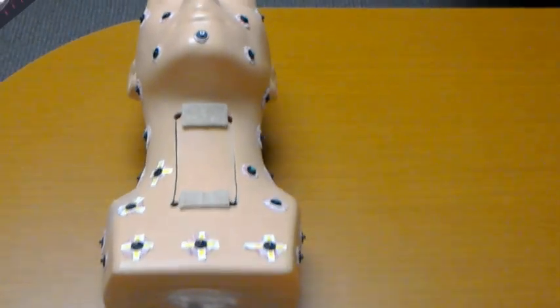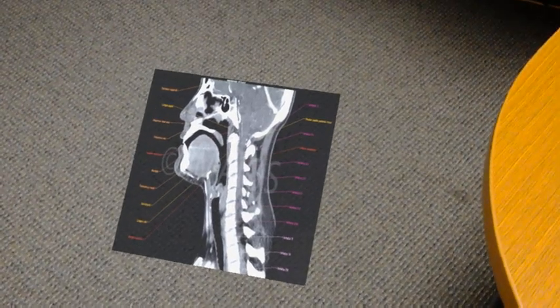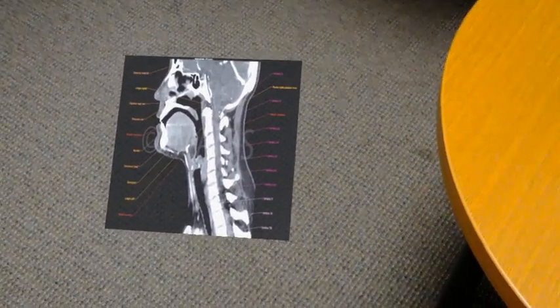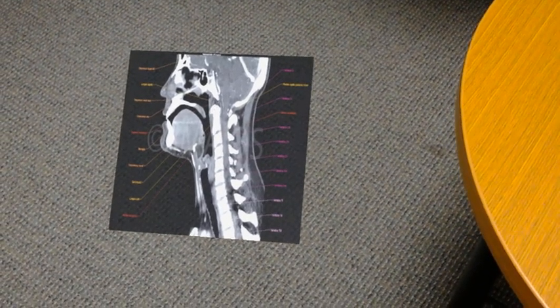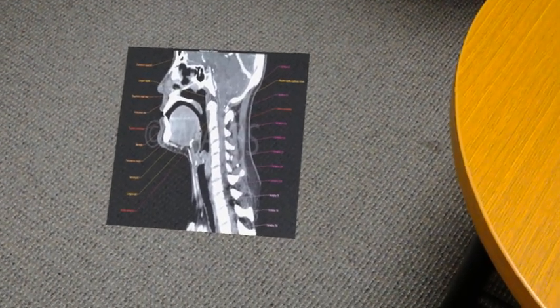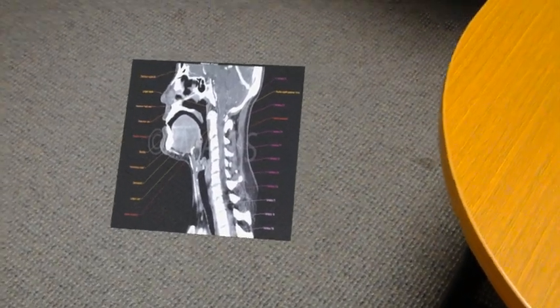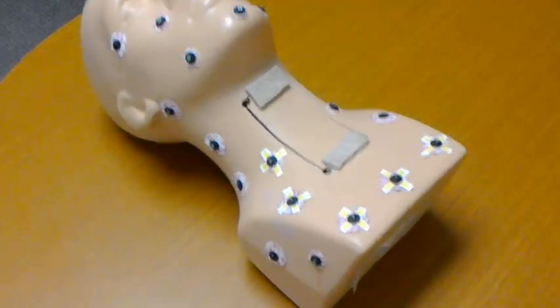Before I do that, I want to point out one thing in our virtual environment, and that's just a CT scan that we've located over here. It just gives a demonstration of the kind of information you can arrange in the virtual environment that might help you, whether it's imaging like a CT or MRI, or maybe access to medical records, or even a video consultation if needed. So let's work our way back over to the physical model of the head and neck.